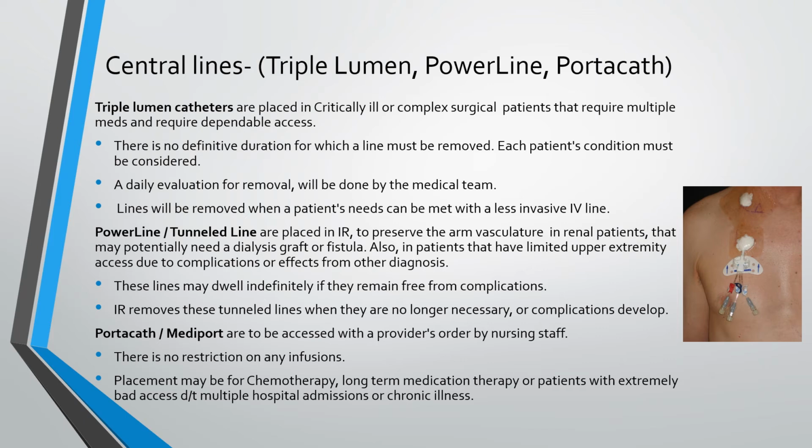A portacath, also known as a mediport, is to be accessed with a provider's order by nursing staff. There is no restriction on any infusions. Placement may be for chemotherapy, long-term medication therapy, or patients with extremely bad access due to multiple hospital admissions or chronic illness.